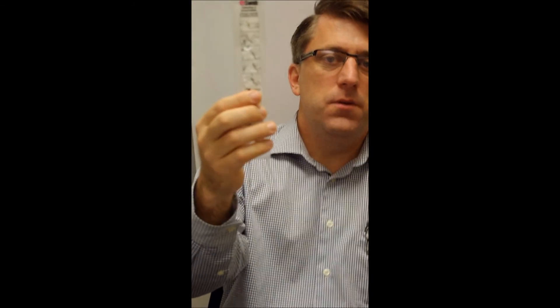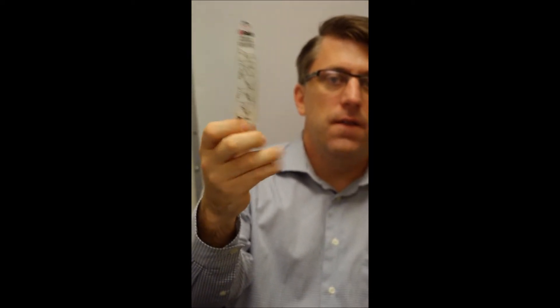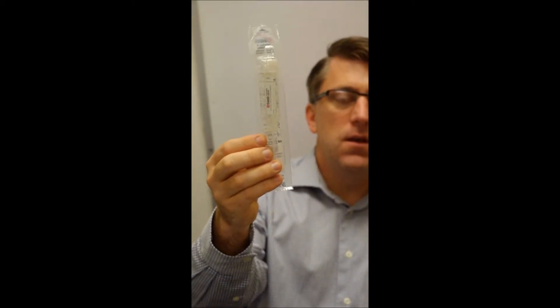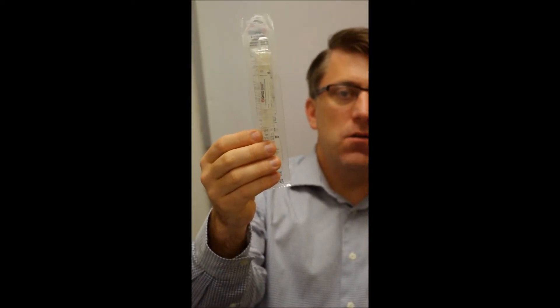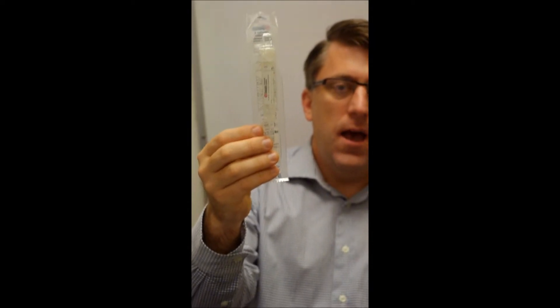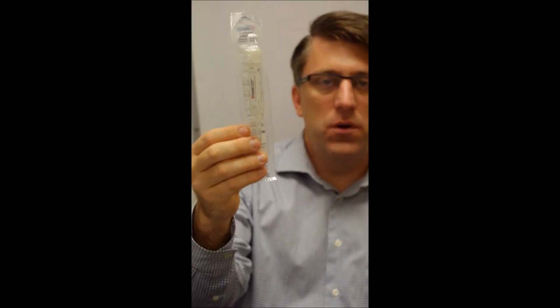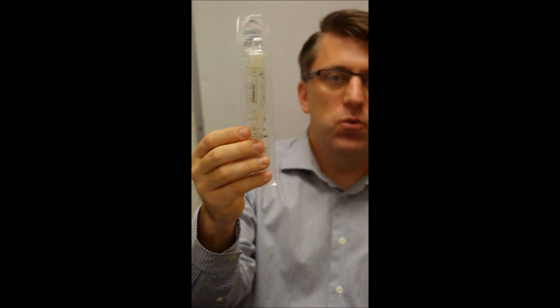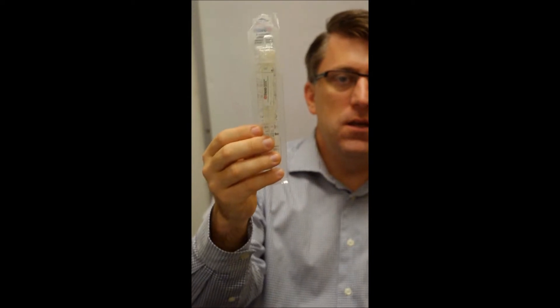The first instruction we're going to cover is the collection of the three specimens from the throat of the child in the Janeway emergency room. The swab we're going to use for the study is called the e-swab. The package contains one swab and one transport media. In the study we're going to be collecting three swabs from each child at one time, so you only have to go into the throat once to get all three swabs collected, all three of which will be submitted in this e-swab format.